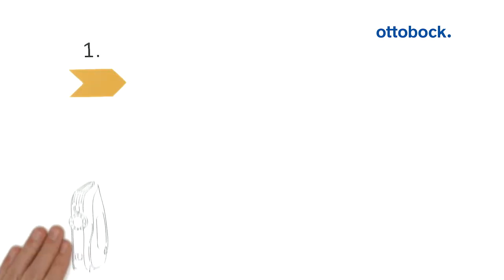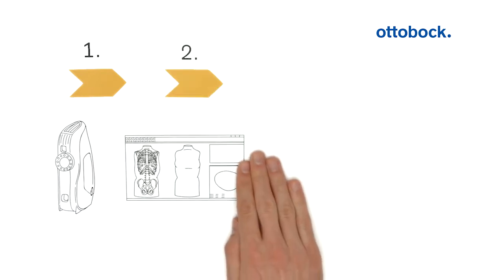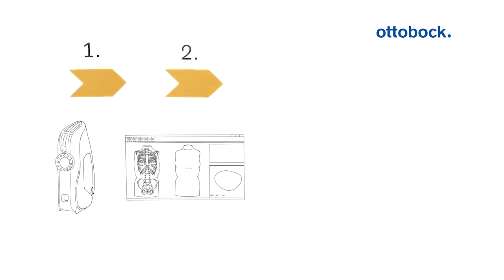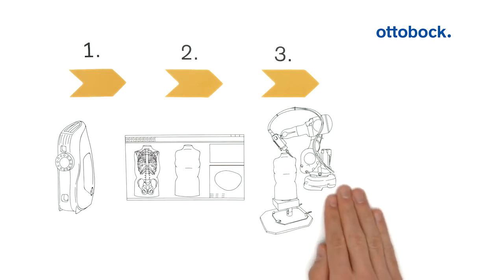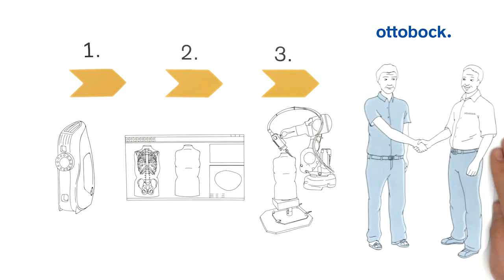Step one: use a scanner to digitize the body part. Step two: use the CAD software to modify the scan. Step three: Ottobock will manufacture the product using the CAM method and provide support if necessary.